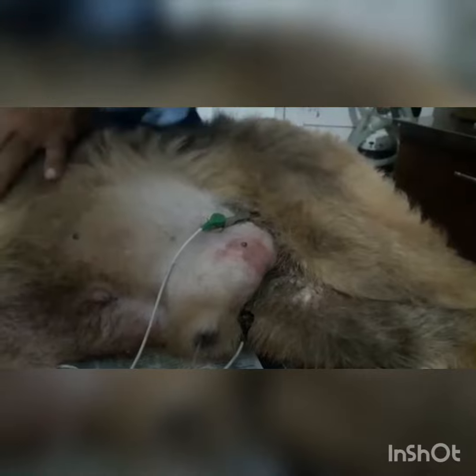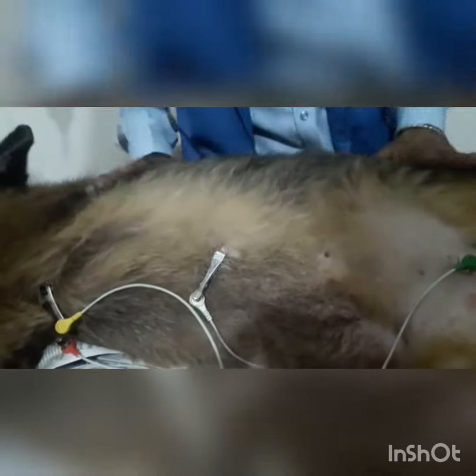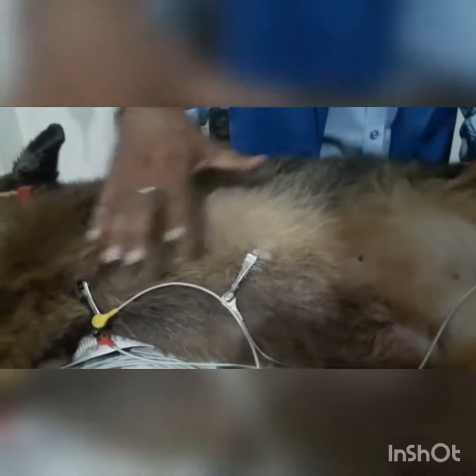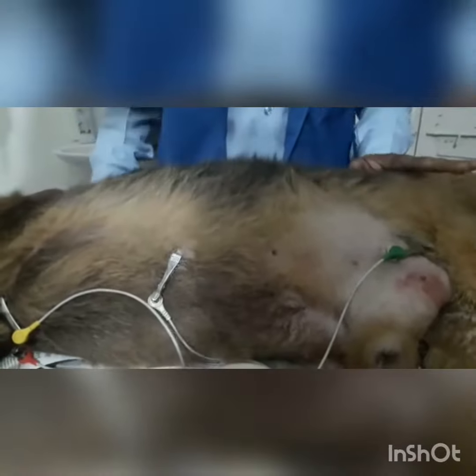And this is the gray clip which is for the heart. I have applied some gel, then applied this gray clip. So these are the 5 clips. Yellow and red are for the forelegs, black and green are for the hind legs, and the gray one is for the cardiac area.